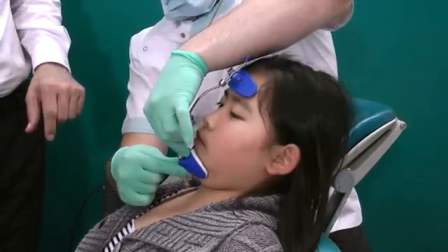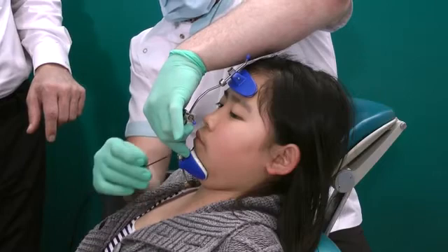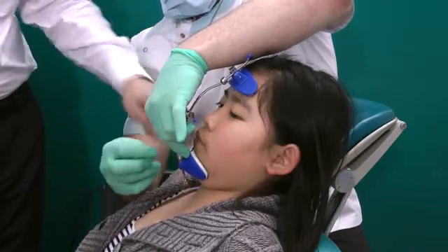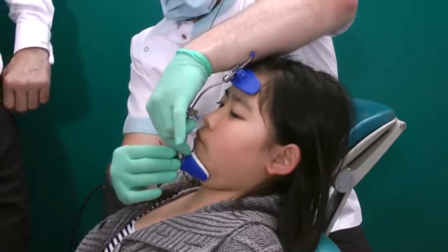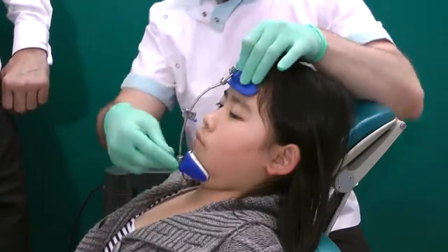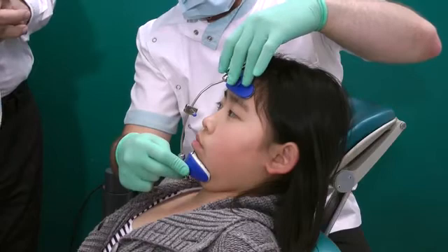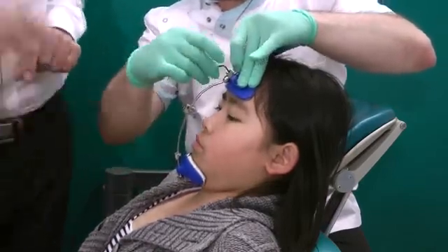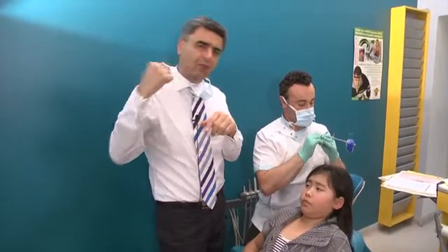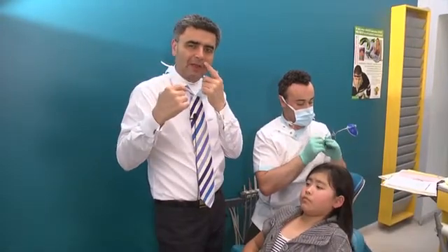Using the Allen key, we'll do the chin cup adjustment. Just while the chin is being adjusted, you can see where the middle bar is. The middle bar should always be about 15 to 30 degrees downward and forward of the occlusal plane, and that gives us the best vector of pull.